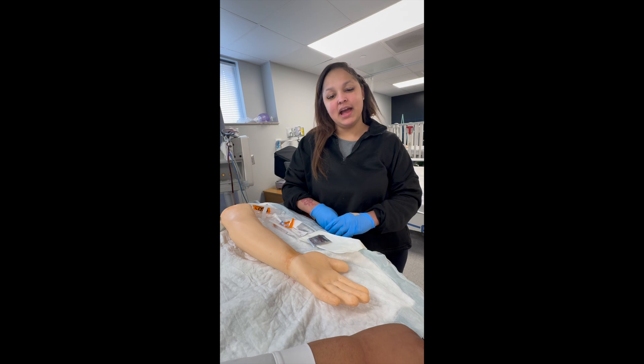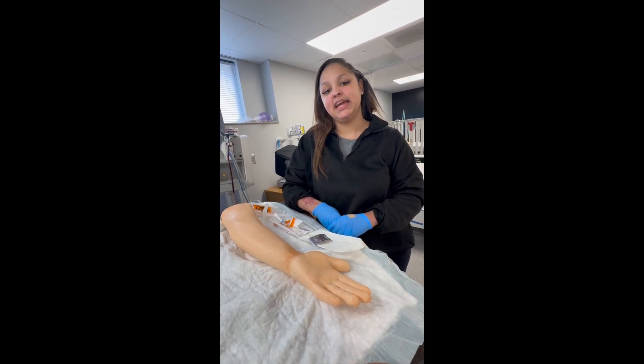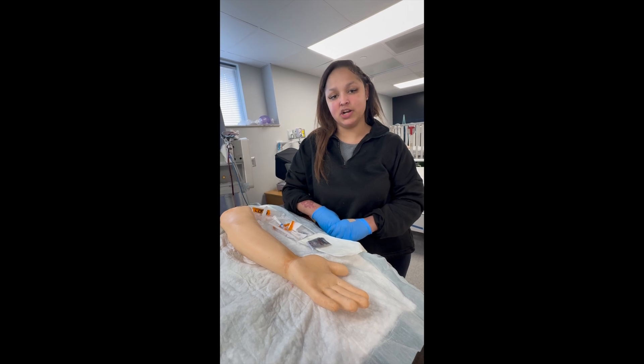Hello, my name is Chloe Taylor. I'm a senior respiratory therapy student here at Jacksonville State University, and today I'm going to show you how to draw an arterial blood gas.